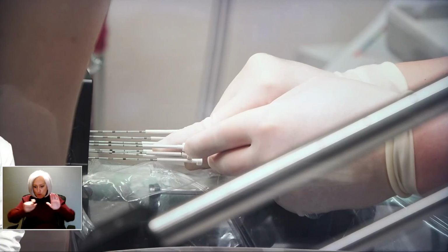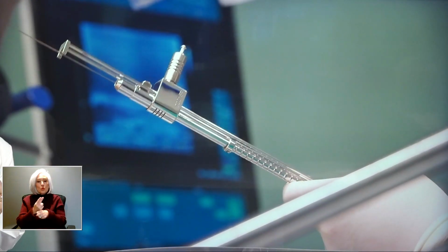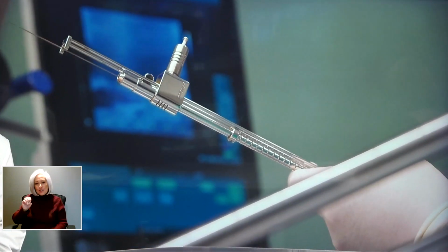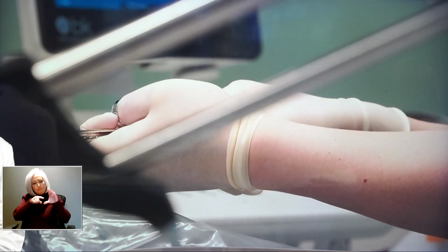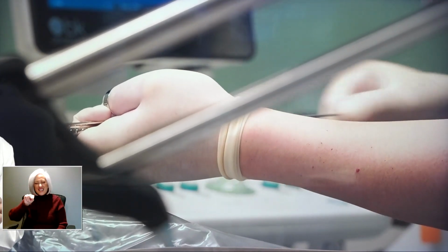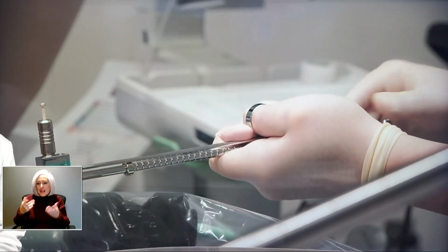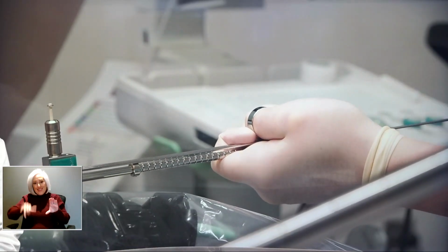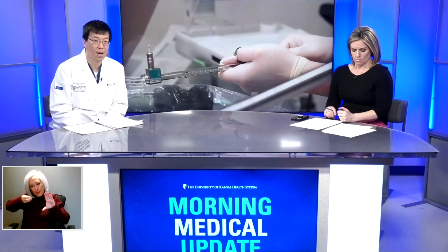It's not surgery. And the entire procedure, I use needles to help me put seeds in the prostate. And what I usually tell patients is that the entire procedure takes, on average, about 15 needles. So about 15 needles into the prostate. And for many prostate biopsies, just to diagnose the cancer, biopsies take 12, 15, 18 needles. And in that sense, brachytherapy is actually kind of similar to just a biopsy.